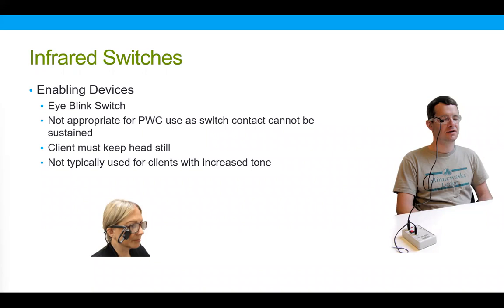It would be possible again to use latch, but here's where it gets a little complicated. Someone who's using an eye-blink switch probably can only use one switch. It's possible to drive a chair with one switch, but you have to use something called scanning. And it's a challenging way of driving. And if I'm in latch, I have to wait for my scan to get to a reverse command.